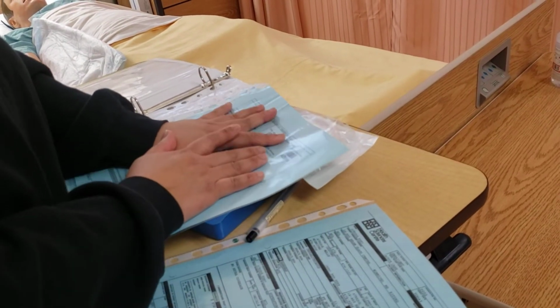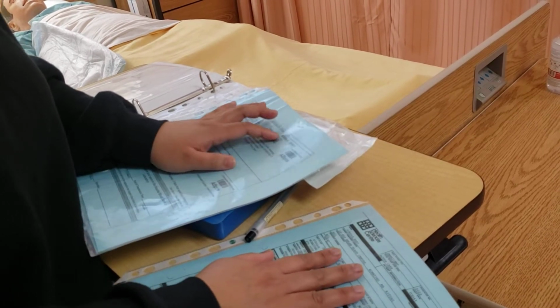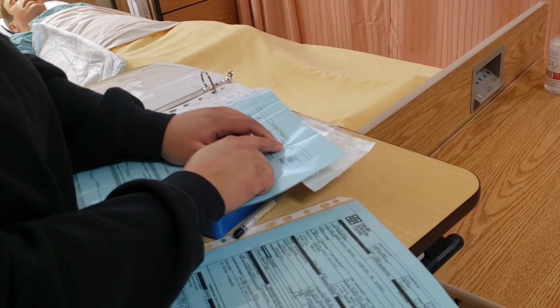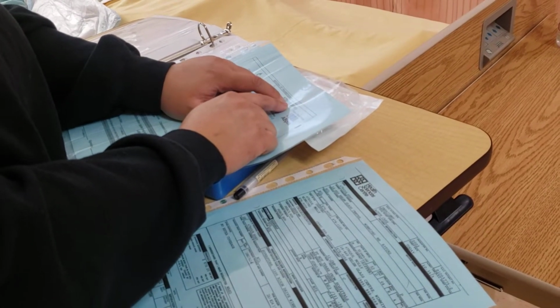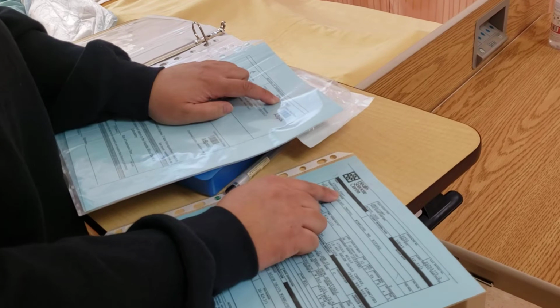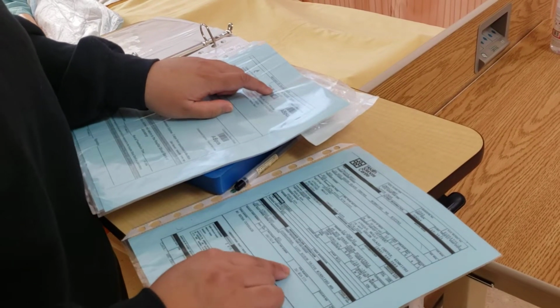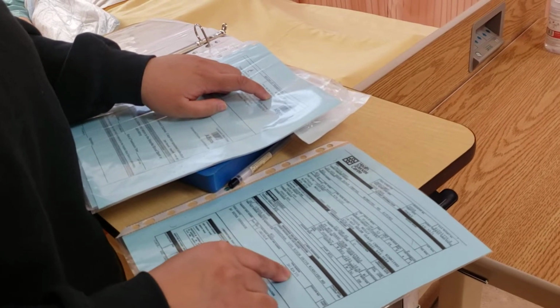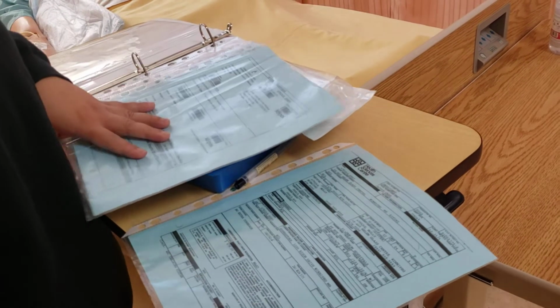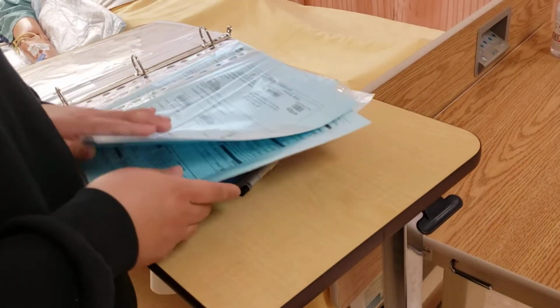So I'll be checking the record of transfusion. My second nurse will be checking the demographic sheet. So we'll spell out the last name. Last name is Antrique, A-T-R-I-Q-U-E. First name is Jerry, J-E-R-R-Y. PIN number is 261-824-735. And then my second nurse will just acknowledge if everything is correct.